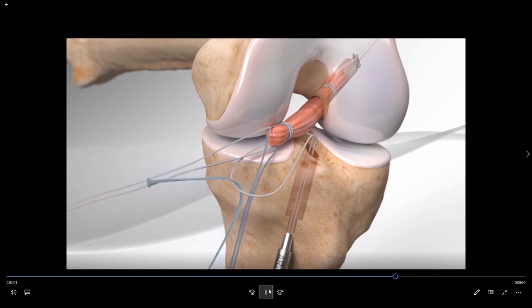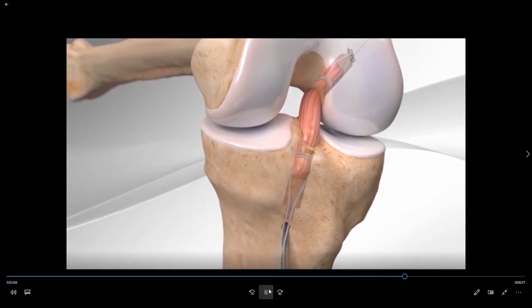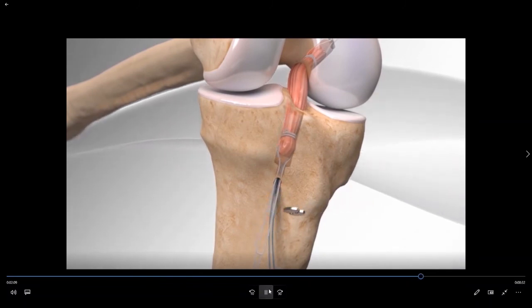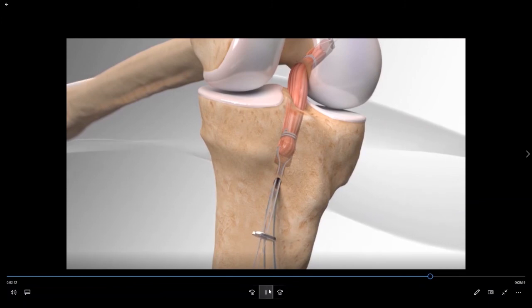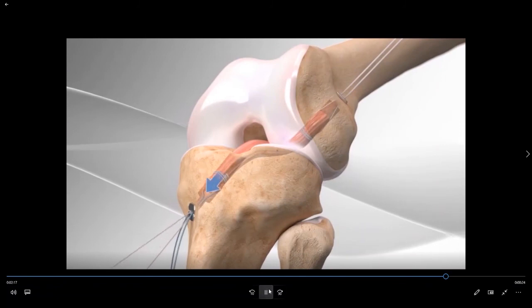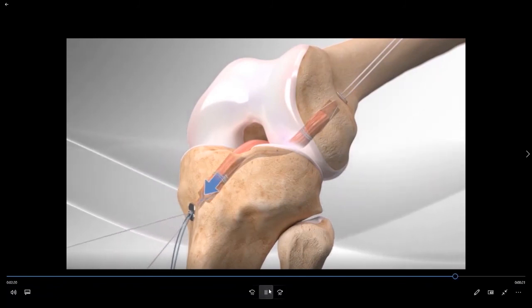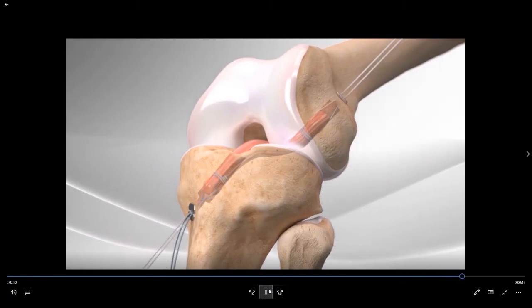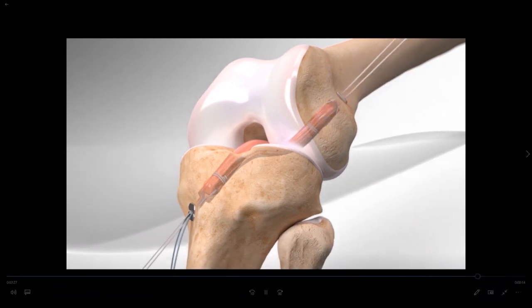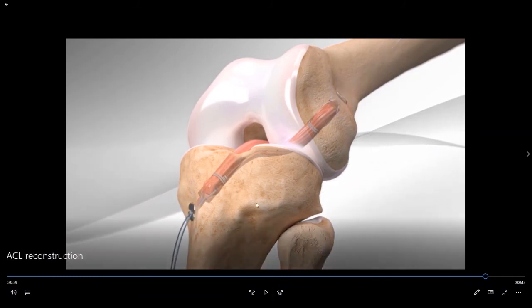We then pass the tibial side of the graft down through the tibial socket and apply a second button. Once we have the button on the tibial side, we can sequentially tighten both sides of the ACL graft until we are happy with the overall graft tension. With the all-inside technique I am able to fine-tune the tension of this graft on both the tibial and femoral sides.